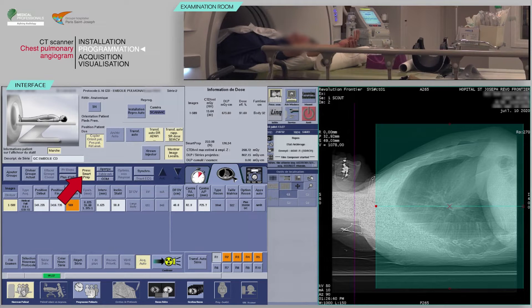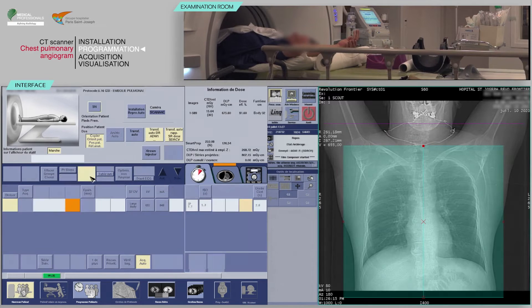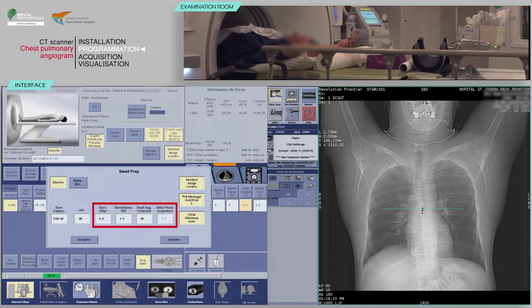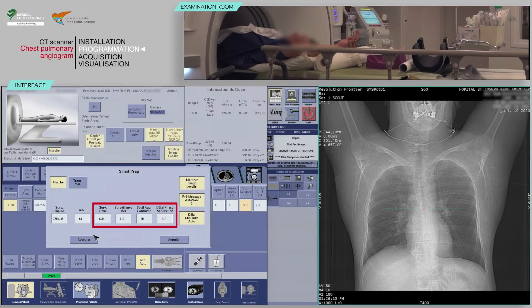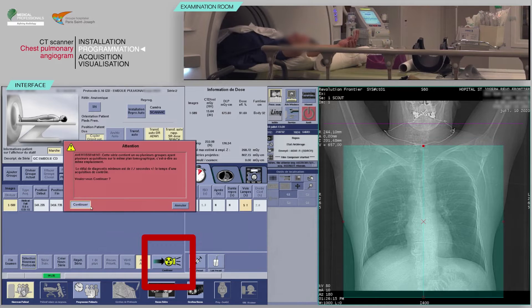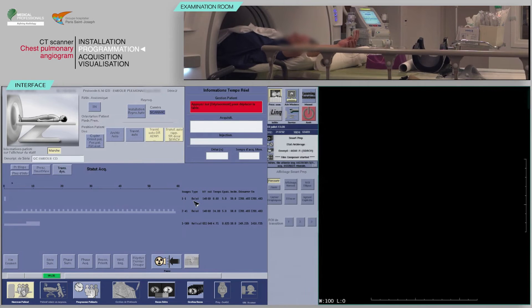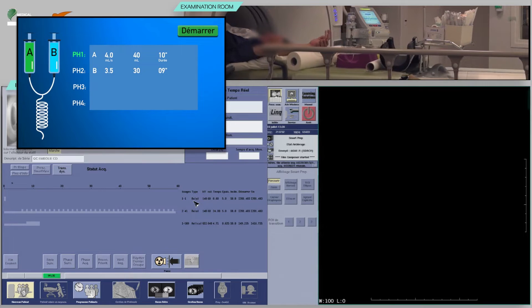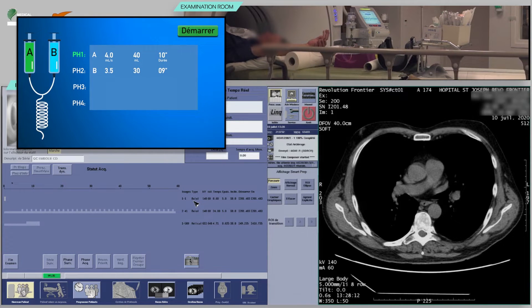Click the Smart Prep icon to check the bolus tracking settings. On the right screen, place the position of the control slice, usually just below the carina. At least one tracking image should be obtained at this level before the arrival of contrast media. A low monitoring time and a low threshold of enhancement should be chosen for a quick acquisition start. Using the keyboard, move the table and launch the acquisition to obtain the control slice. Before starting your scan, program the injector with your service protocol.